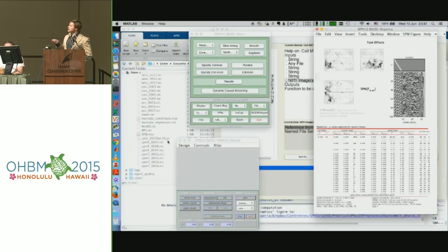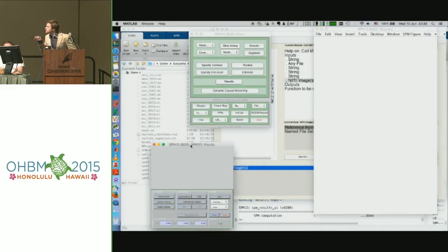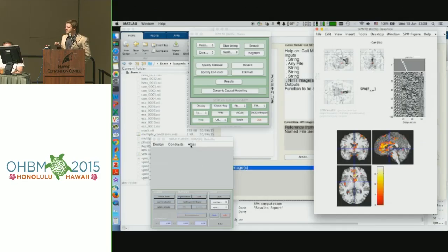And each of those is output actually into this SPM PostScript file. Each of these plots you've just seen. Plus there are now these plots which have the structural underlay, which are output into this physio.ps file here. And you can look at them offline.